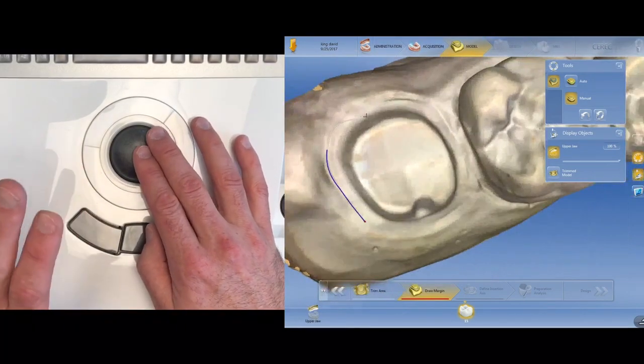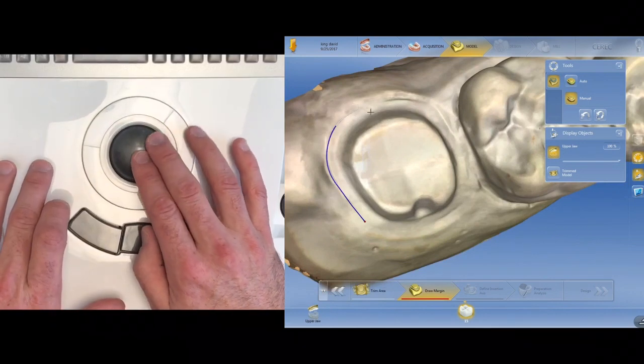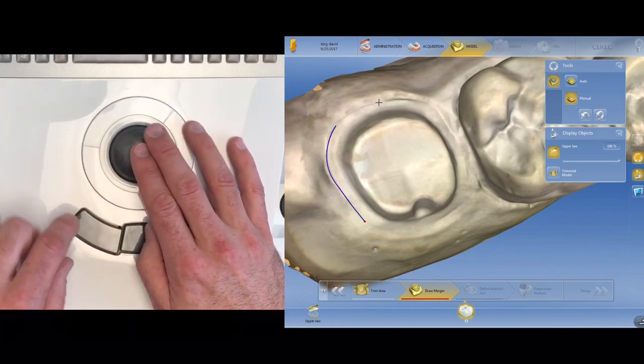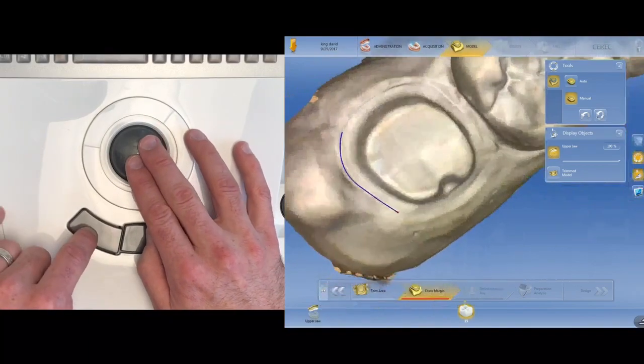Now if I let go, that margin's still unattached, right? So if I were to press and hold and then rotate, it doesn't grab the model. But if, I'm sorry, press and release and then rotate, it doesn't grab the model. But if you press and hold, it grabs the model, so you can move it around. You get a better view.